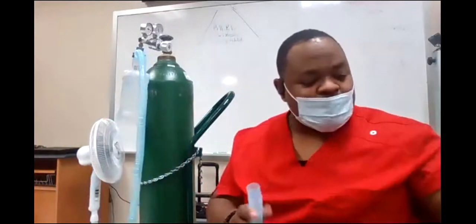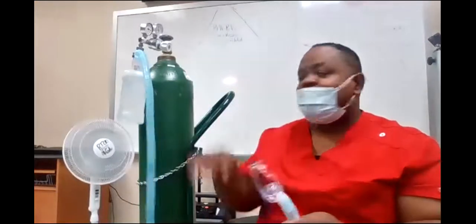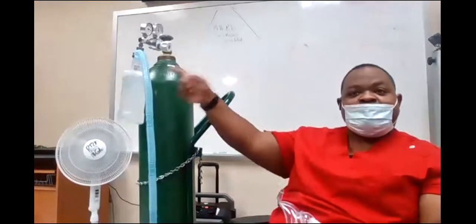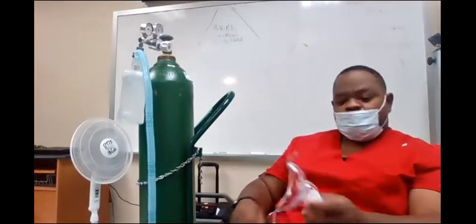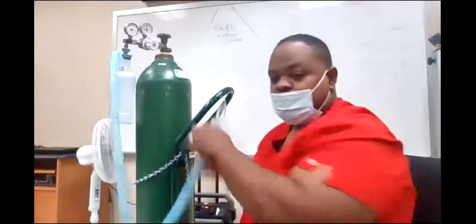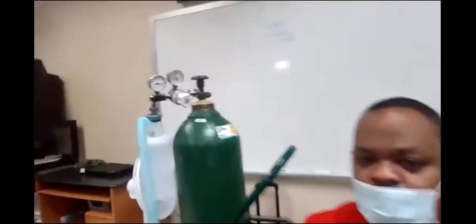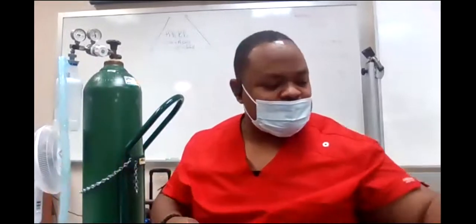So what is this? Aerosol trach. I'll say the whole thing. 40% aerosol trach collar, because that's what I got it on, 40%, okay? Running at 15 liters per minute. Okay, so I'm gonna let y'all see on camera. 15 liters per minute, and it's a 40% aerosol trach collar. All right, so say it again. 40%. All right, what is this?